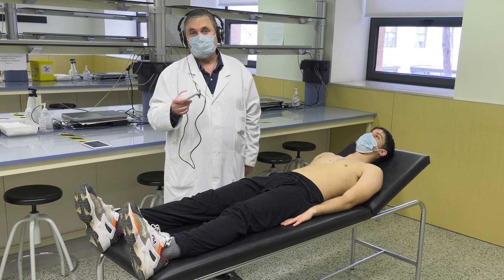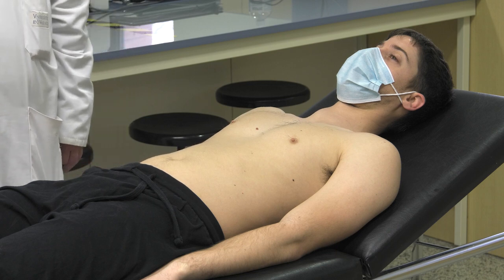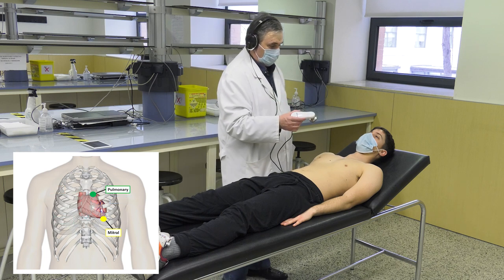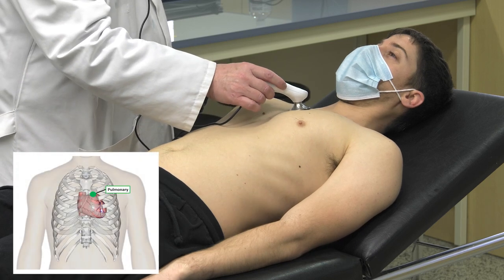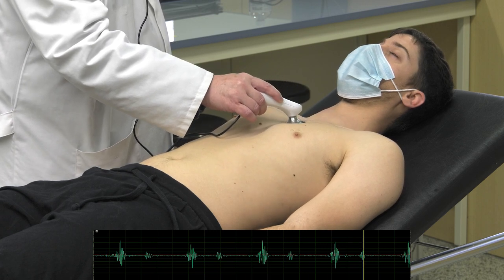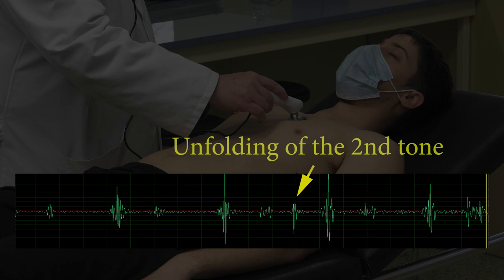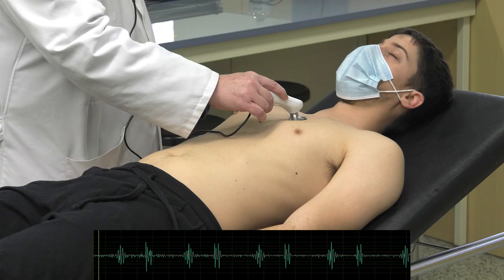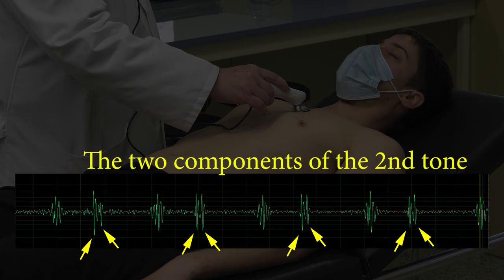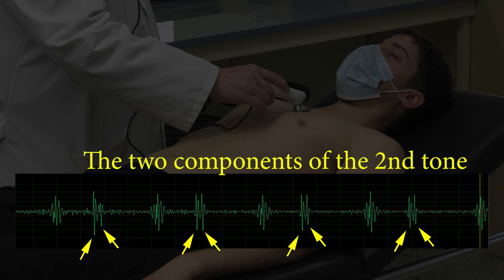To favor the unfolding of the first and second tones, we are going to take a deep inspiration followed by a deep expiration. We auscultate the mitral and pulmonary foci. Please breathe in and out deeply. In this case, the two peaks of the recording correspond to the two components — aortic and pulmonary — of the second heart sound.